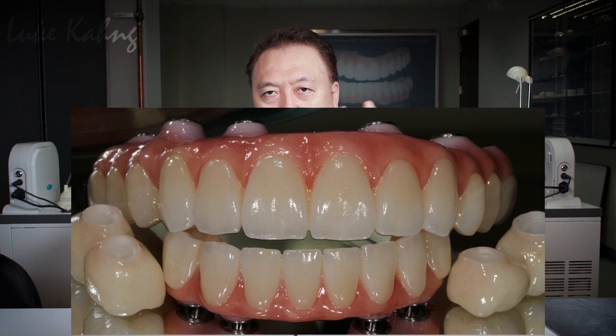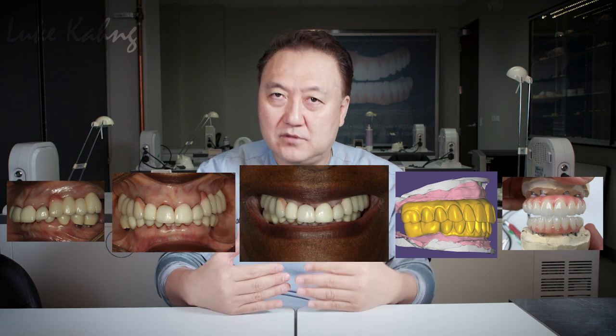We treat the patient — especially, she is an ex-police officer who just retired from the police force. She wants good teeth and good occlusion contact. We made the fuse, monolith here and there, with great custom tools. All the way from Chicago to Texas and back and forth — that's why I'm trying to show you: my passion is here. We set up all different stages because we do have heart. That's why they pay for this. Otherwise, you just send it out to a machine, give it to a technician, have them paint it — but I'm not that kind of guy. Welcome to the good laboratory.